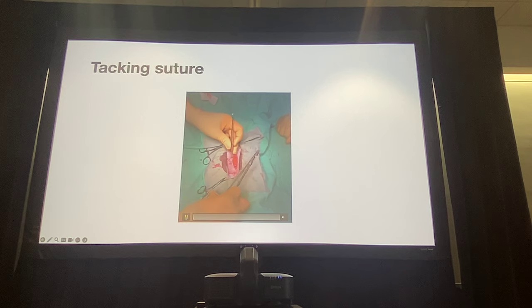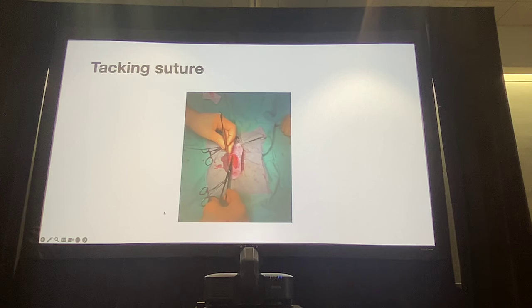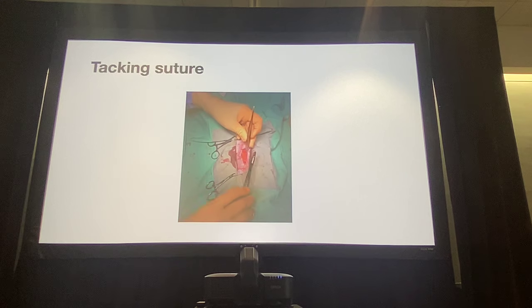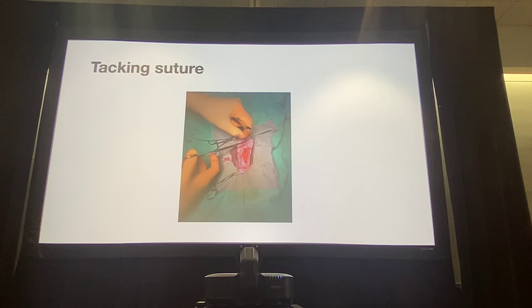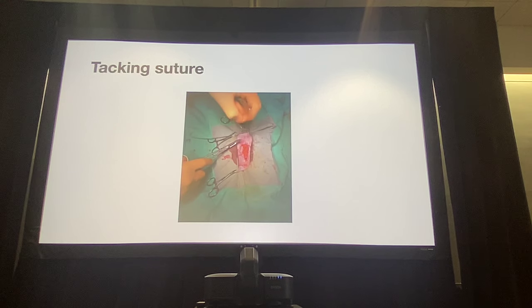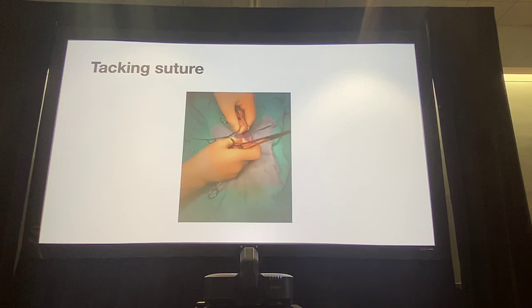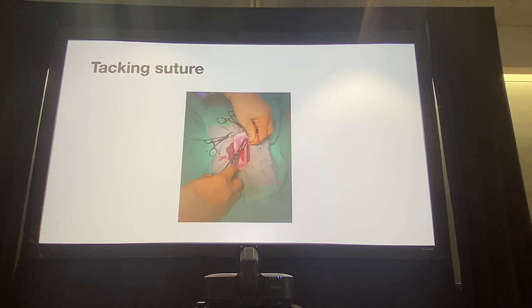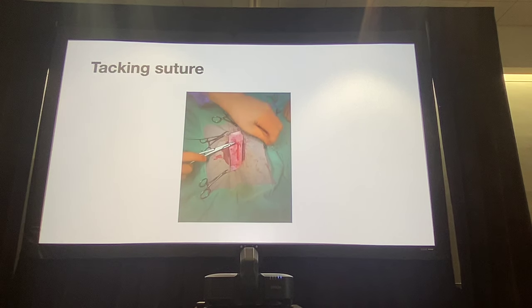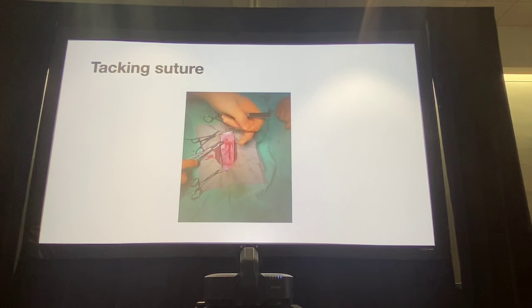This is the one where you're going to want to use the incision at the end of the board, the bigger incision. There's more room there. Take your first bite, just like you normally would. Take another bite, like you normally would. But now instead of going and tying your knot, you are going to take another bite in the actual incision itself, the deeper layers. And then when you take that bite, you then tie your knot. What that does is it helps the skin oppose each other by securing it in the middle within the incision.